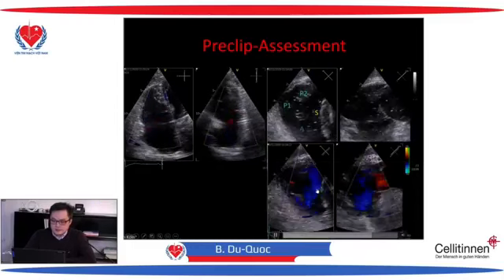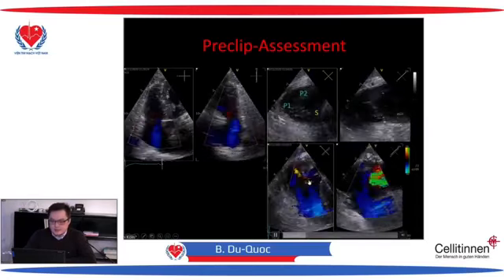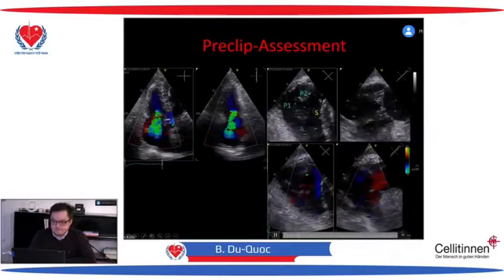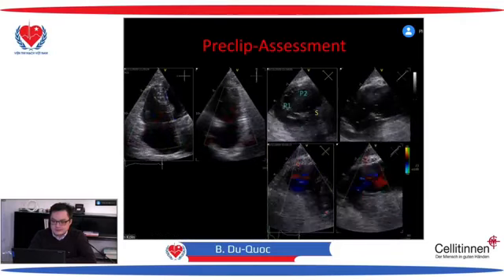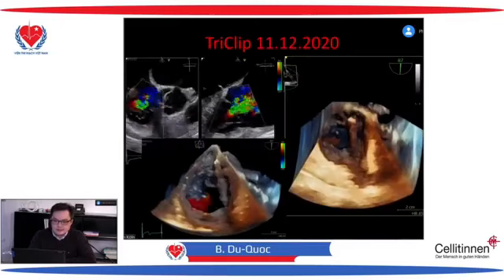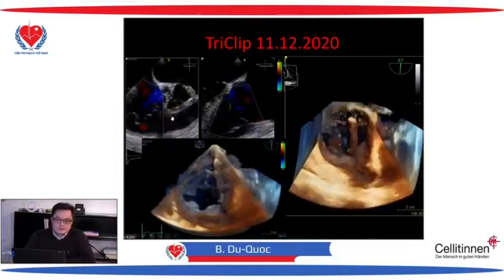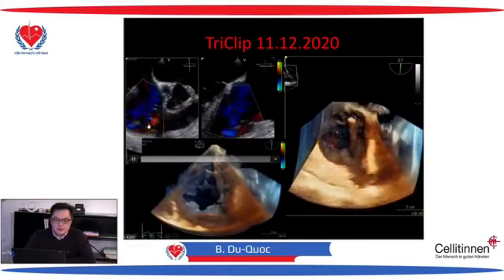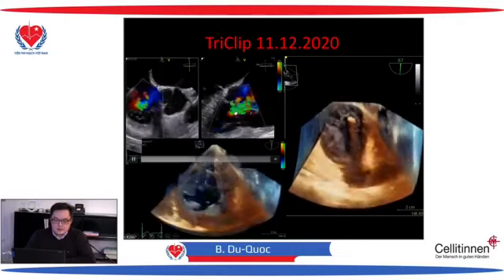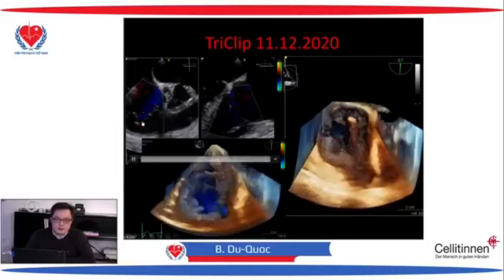And here the color Doppler with this anteroseptal central vena contracta. And in the lower image we measure the vena contracta of the tricuspid regurgitant jet, between the septal and anterior leaflets. Yes. And here is our inflow-outflow view with color. You see this large convergence zone of the regurgitation in the central part of this commissure.